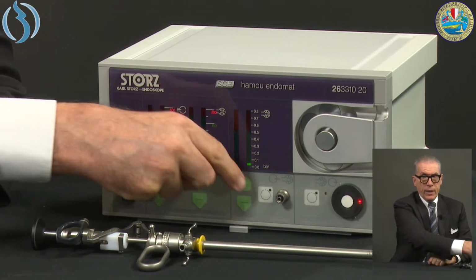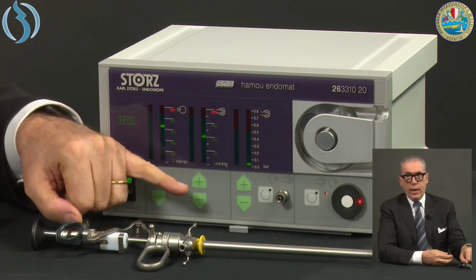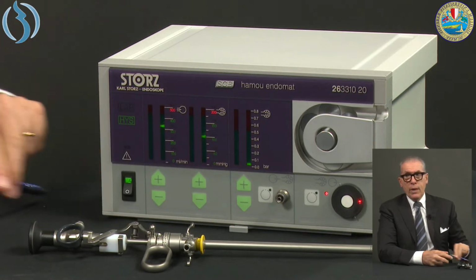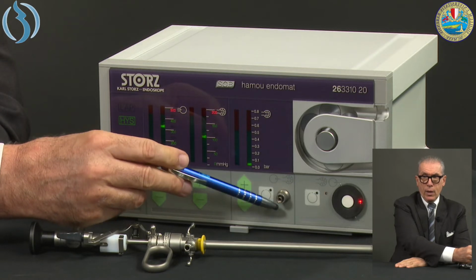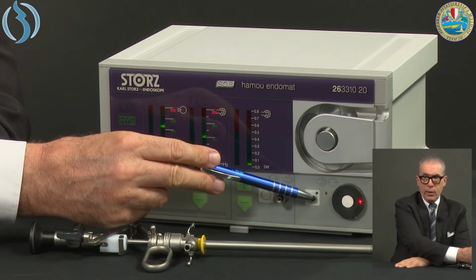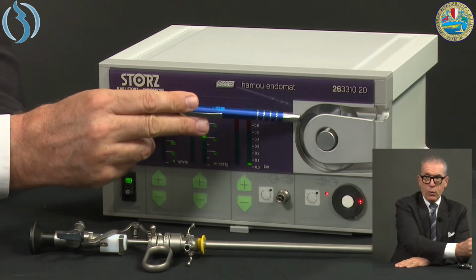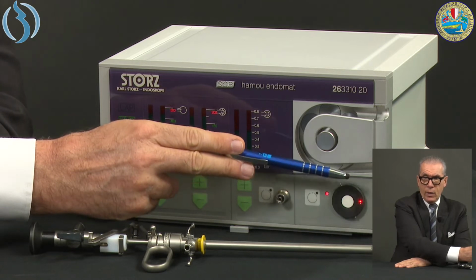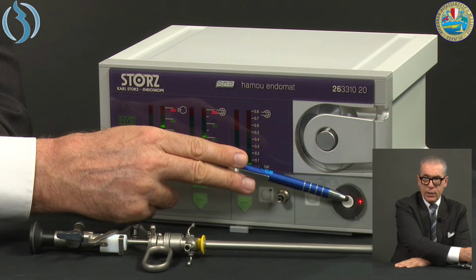This area here is dedicated to the aspiration, so we can regulate the aspiration in bar, and the white button is the button to start the aspiration. The other one here is for the irrigation and starts the rolling pump over here. So we have to set up the silicone tubes, I will show you later, and the sensor and membrane will be plugged onto this sensor.